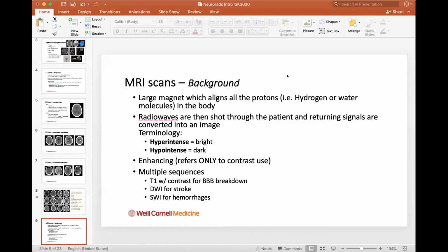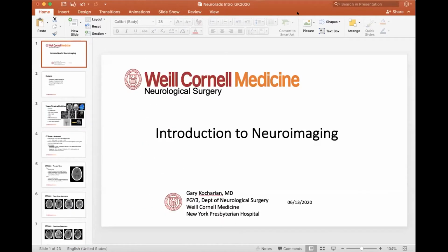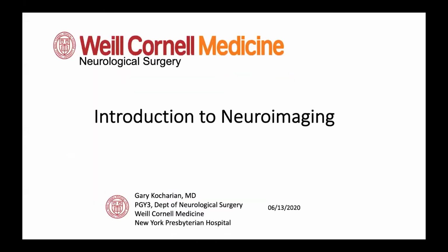When I was starting out as a sub-I, one of the most helpful things in that entire summer at Cornell was when one of my PGY3s, Alexander Ramos, sat me down and explained how I should read, interpret, and present a CT or MRI. I carry that through, and up till residency now, I still use some of the similar techniques.